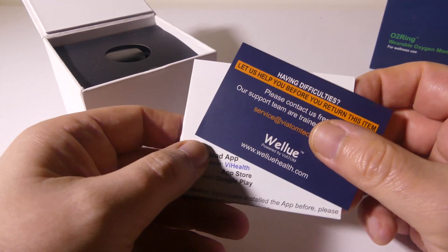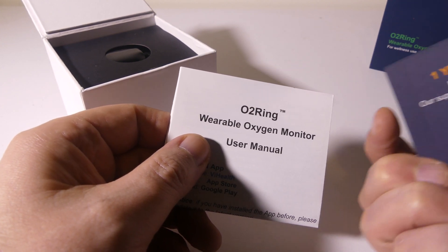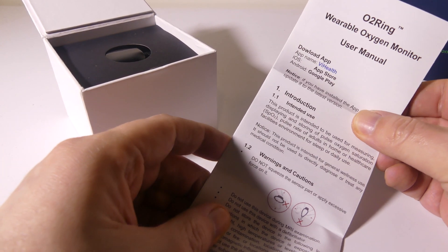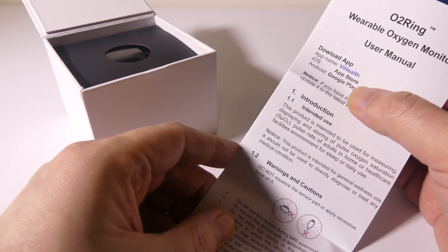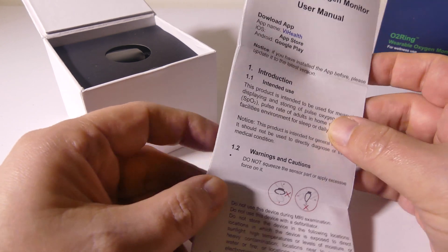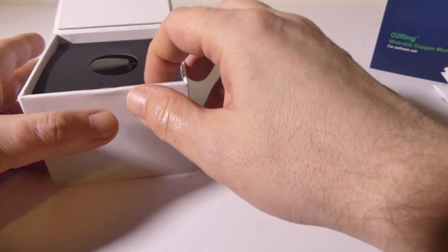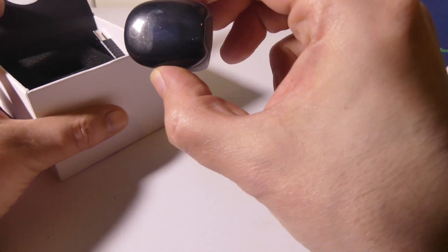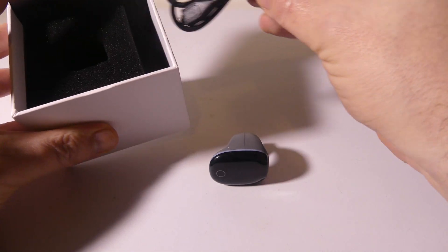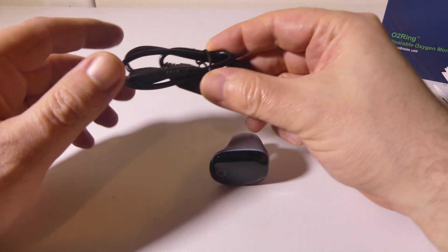Your pulse range is 30 to 250 beats per minute, measured in intervals of one second. It has built-in memory for four sessions of up to 10 hours each, so this is something you can wear at night — great for somebody with sleep apnea or COPD who really needs to monitor overnight oxygen sats. It also has a built-in rechargeable battery, giving you 12 to 16 hours of typical use per charge.